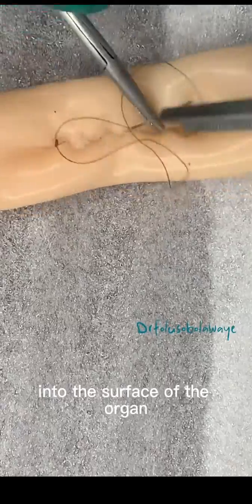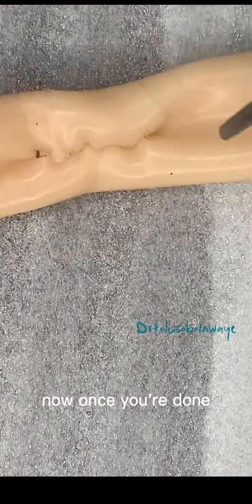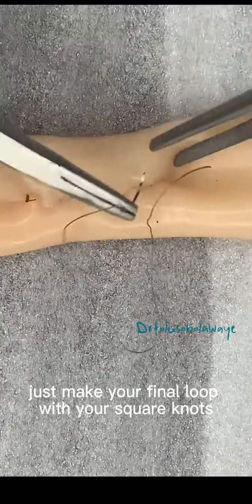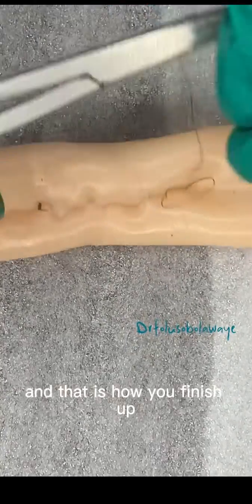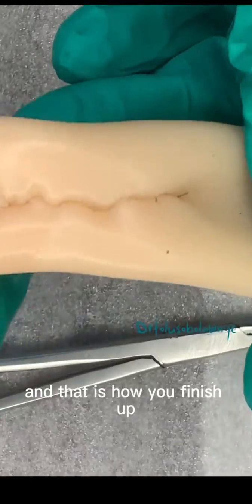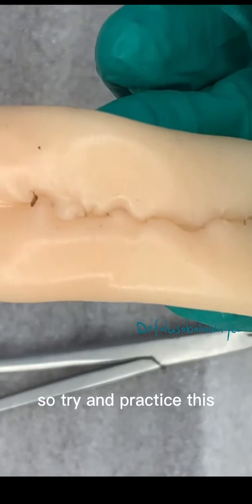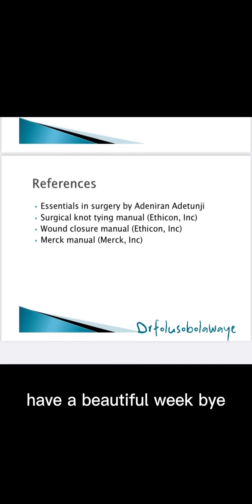Now, once you are done, just make your final loop with your square knots, and that is how you finish up. As you can see, the end product is inverting, so try and practice this. Have a beautiful week!